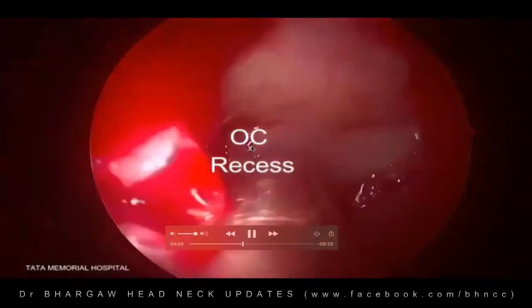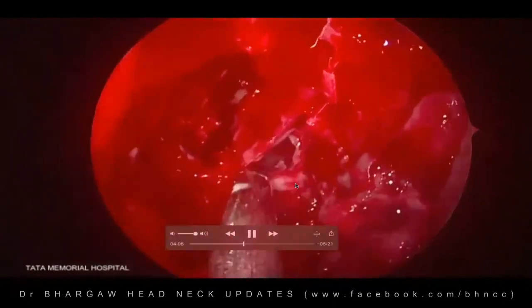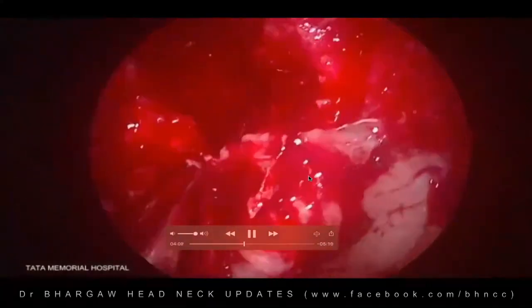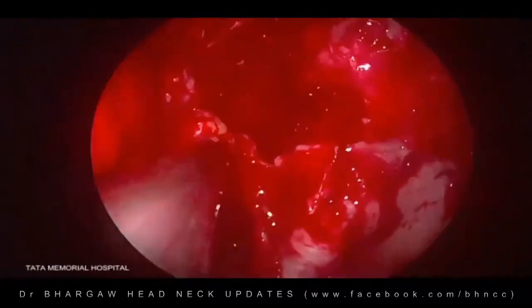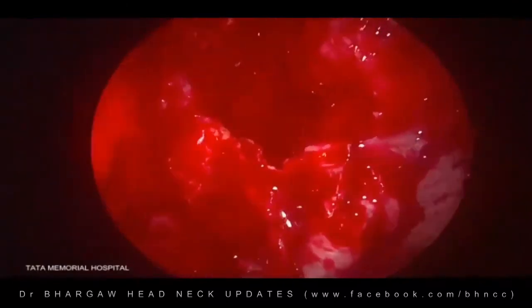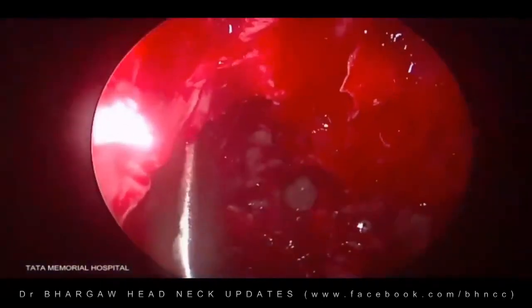You can see the opticocarotid recess here, the optic nerve superiorly. And then we're just removing the, you can see the sphenopalatine artery. That's right, so that's the artery there. That's exactly the artery based on which you raise the Hadad flap. That has to be coagulated properly.